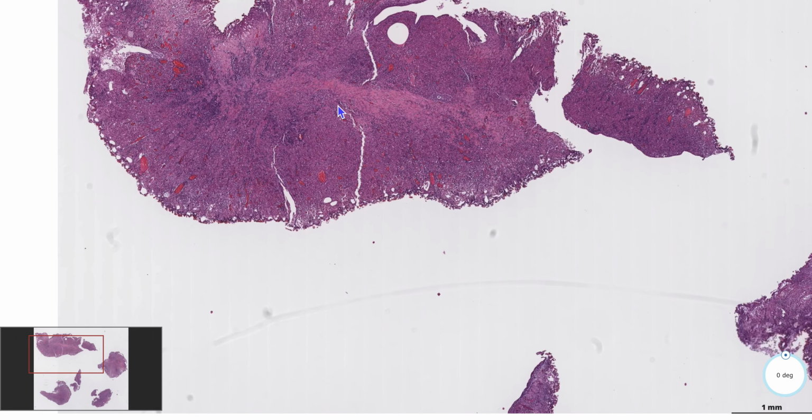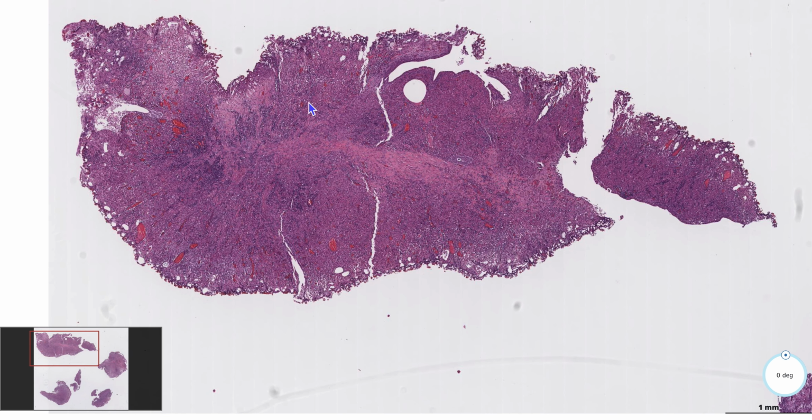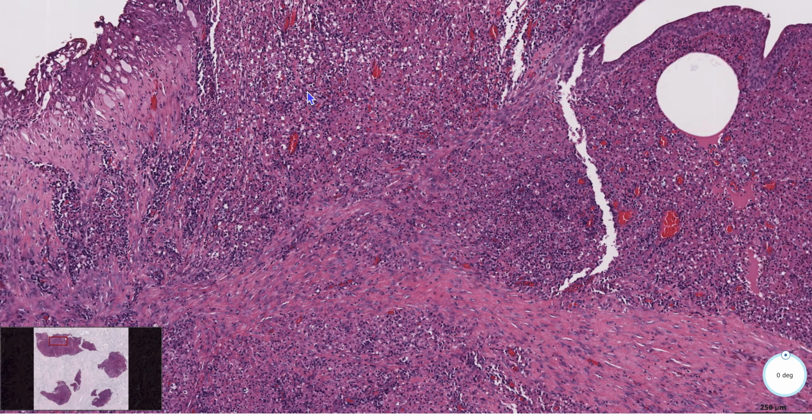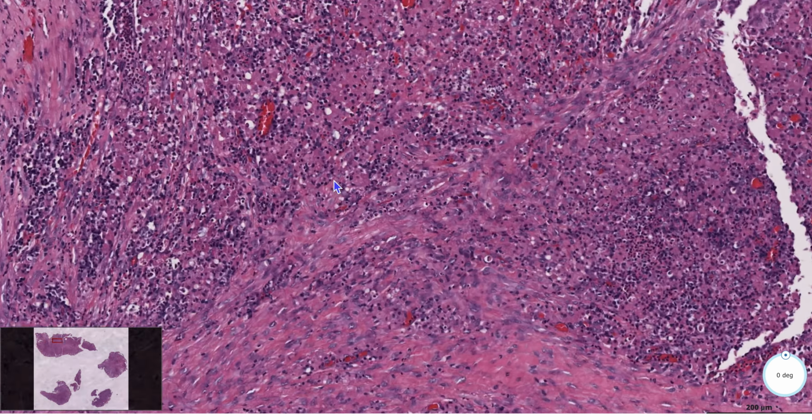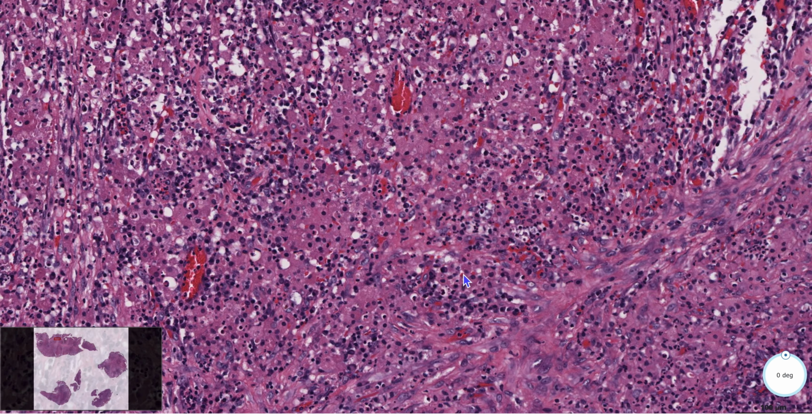And as we zoom in here, I'm not suspecting a urothelial neoplasm or proliferation because it doesn't look like that squamous urothelial look that you get. It looks more like inflammation as well as some scattered blood vessels. So let's zoom in closer here. So we have some histiocytes against a background of acute inflammation and some lymphocytes as well. And this is Malakoplakia.